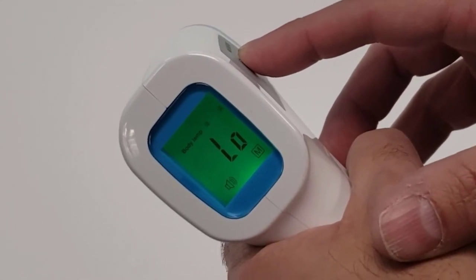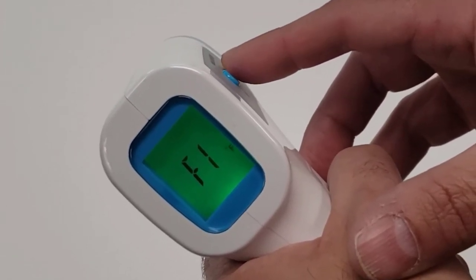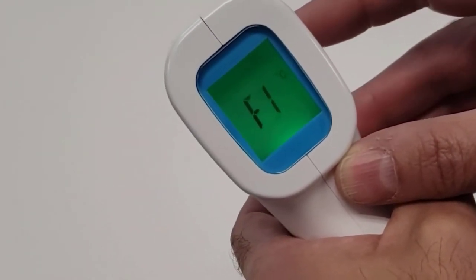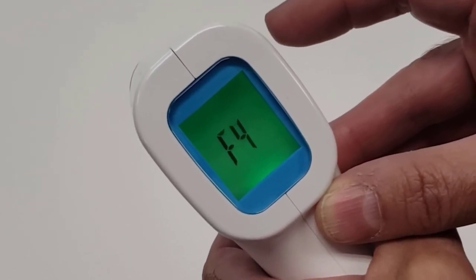This will bring you to the F1 page on the thermometer screen. By choosing the plus or minus buttons, the thermometer switches between Celsius and Fahrenheit. Once you choose your preference, press the set button until the screen goes to F4. The screen will then go dark.